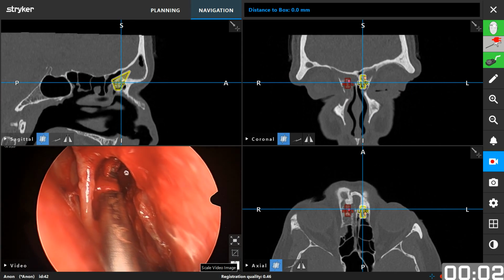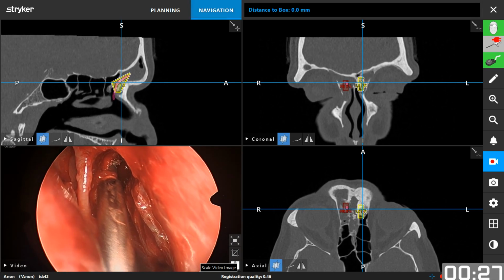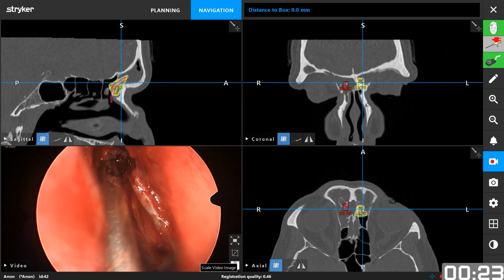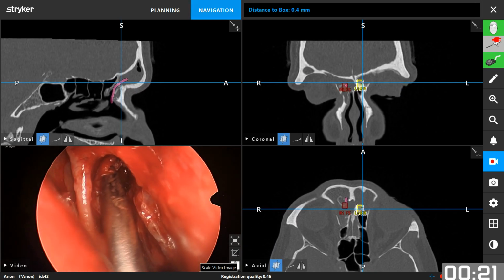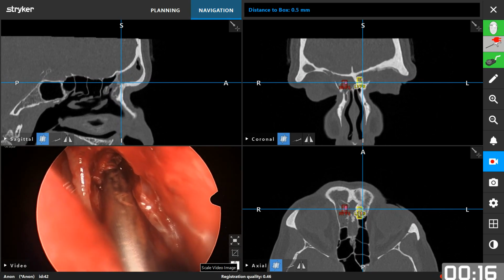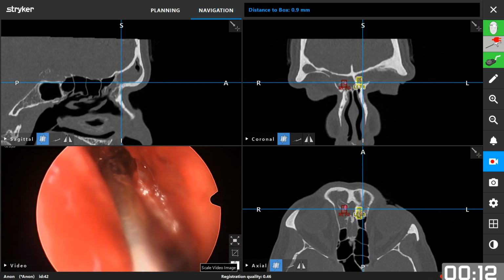If we had the frontal sinus light cable probe, it would help us much, but we don't have it. So we have to do the traditional way. Drilling more, mainly anteriorly at the beak, to remove all of the partitions.